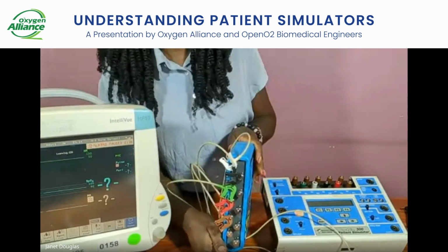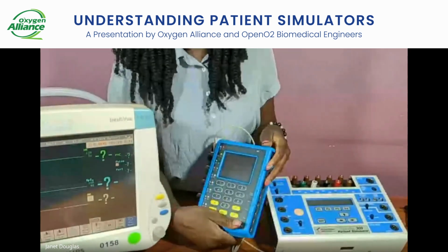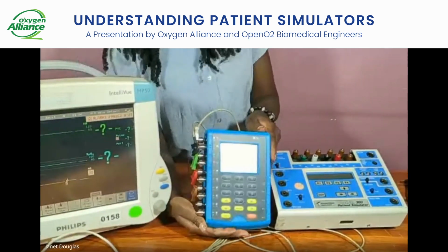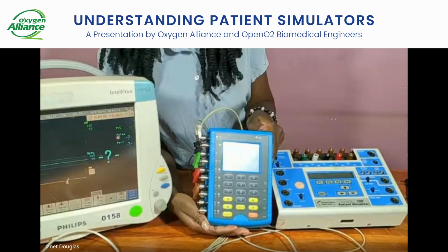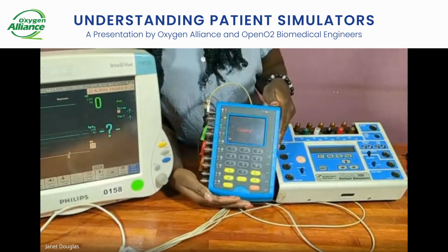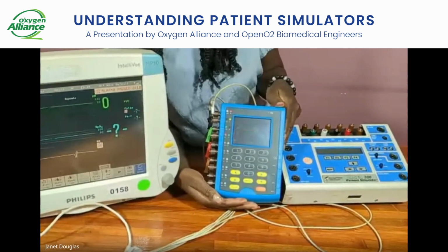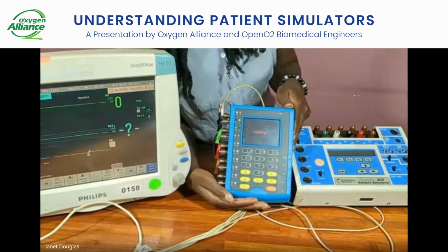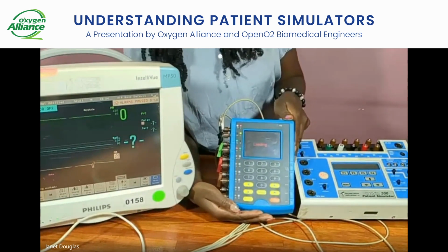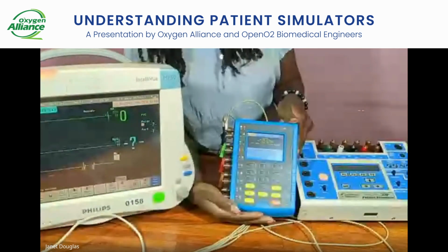So once I'm done connecting, I'll then turn on the simulator. So for this model, it will show you loading and some sort of percentages up to 100, and then it will show you the menu where you can navigate and check other parameters. And for the other brands, it might not even take long about the loading. It will just go straight to the things that you can try to simulate.